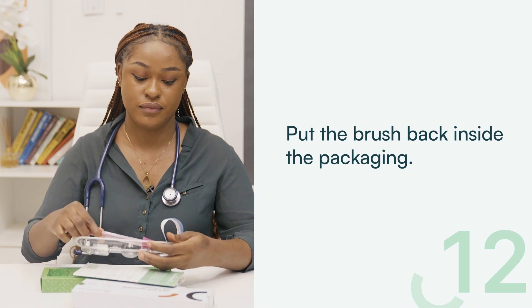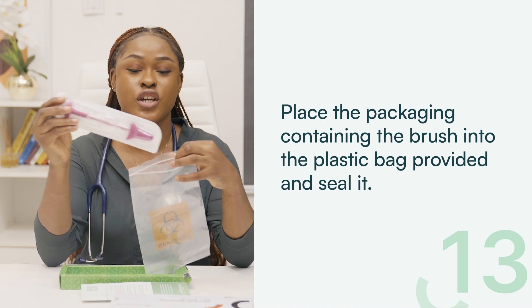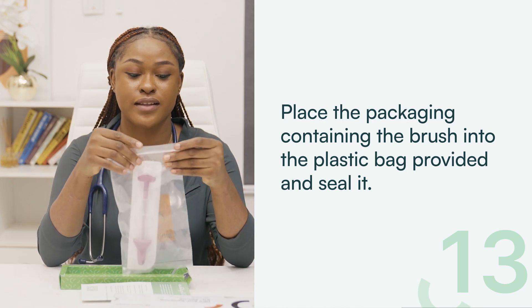Step 12: Place the packaging containing the brush into the plastic bag provided and seal it. And there you have it — you are done.